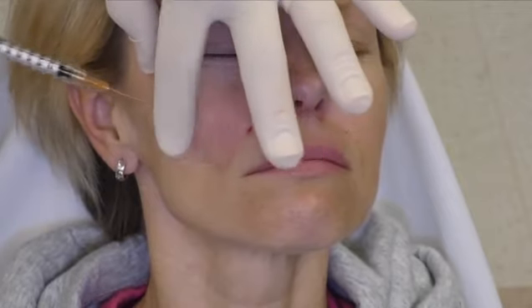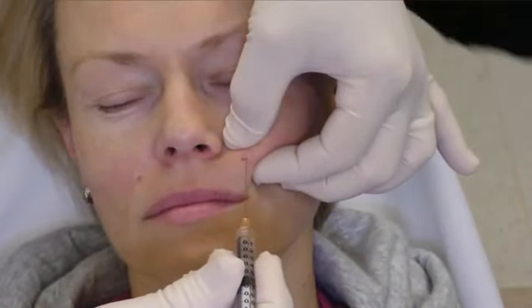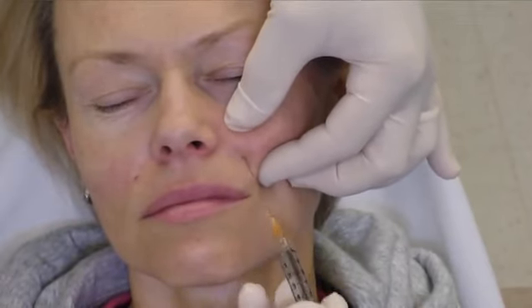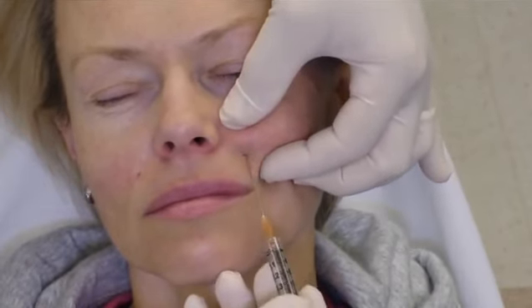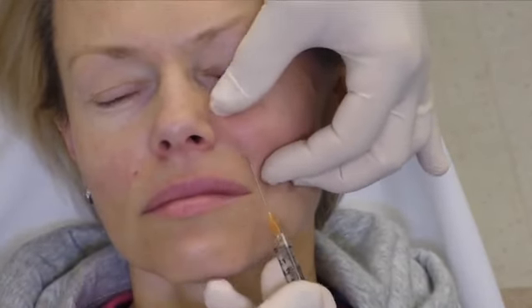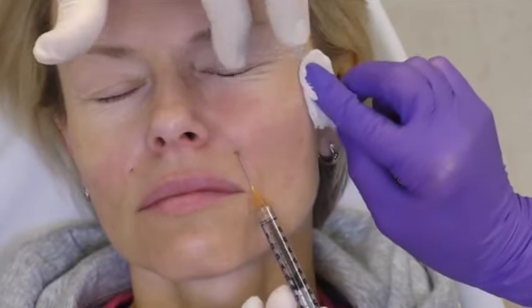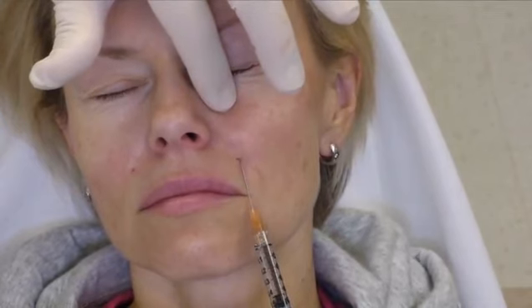By usage of cannulas, the injector knows that the injection placed in this method is superficial to this mass. The contralateral side injection through the peripiriform space is also demonstrated. By utilizing a compartment and space approach, a symmetrical procedure is easily accomplished. Once in the space, the cannula easily passes and traverses all the way up to the orbital retaining ligament.